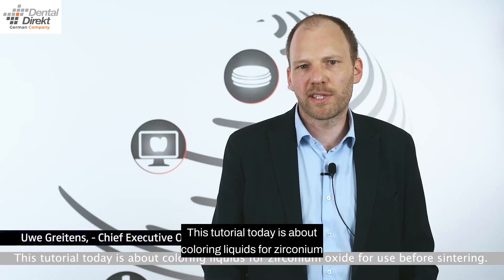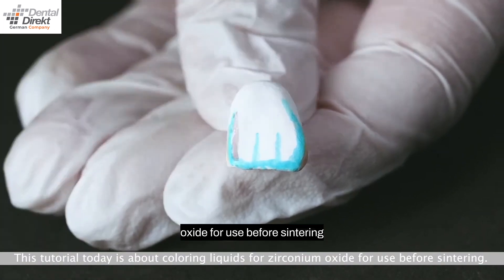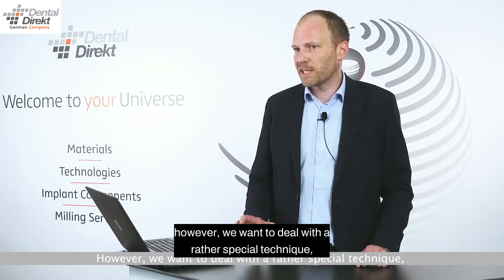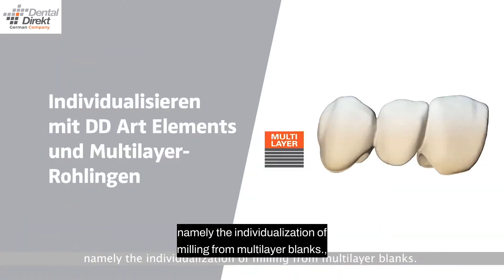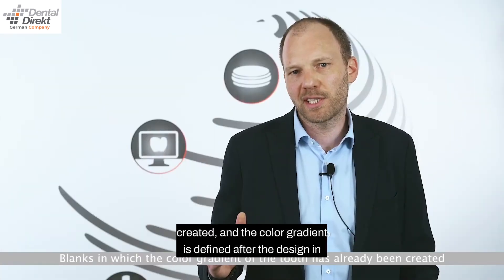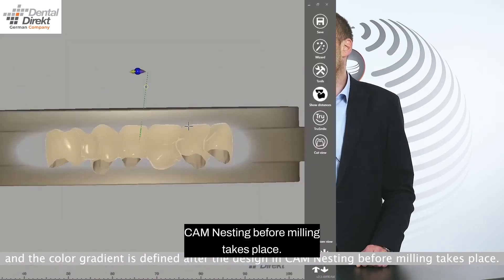This tutorial is about coloring liquids for zirconium oxide for use before sintering. We want to deal with a rather special technique: the individualization of milling from multilayer blanks, in which the color gradient of the tooth has already been created, and the color gradient is defined after the design in CAM and nesting before milling takes place.